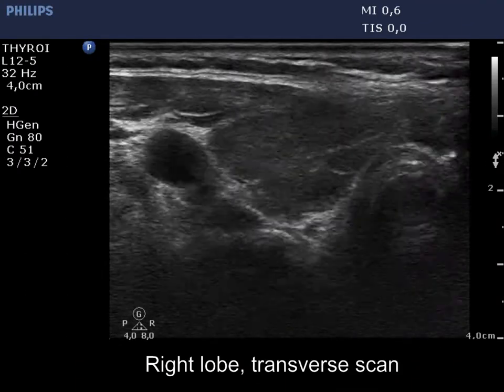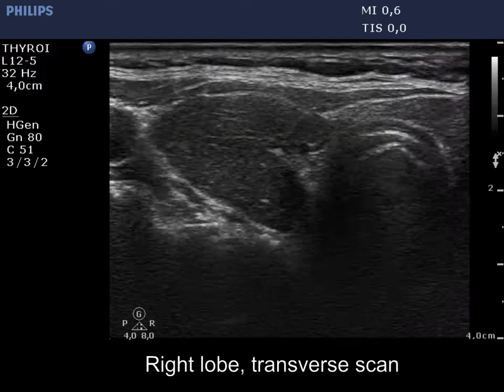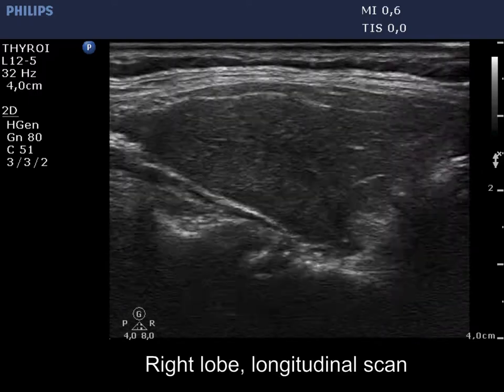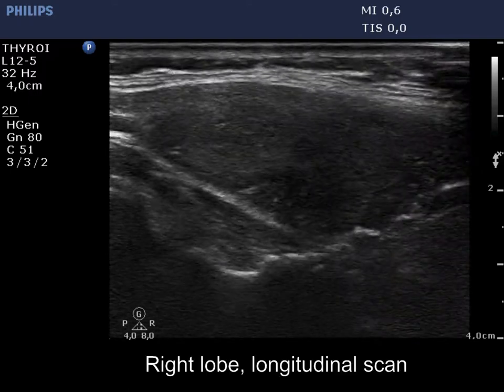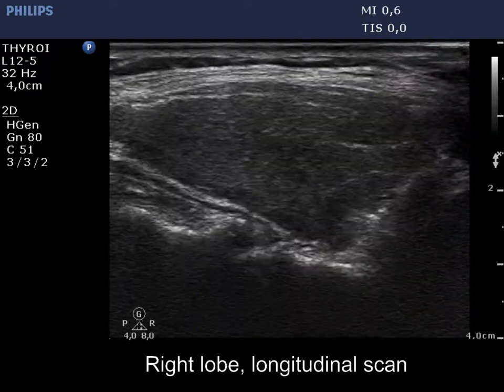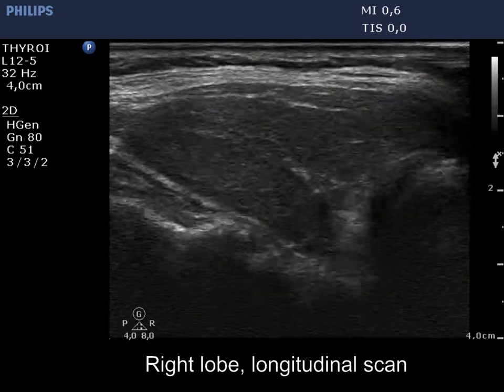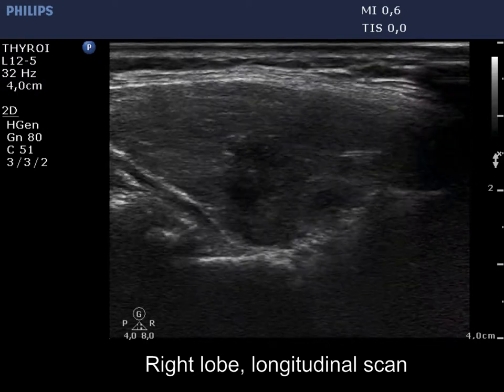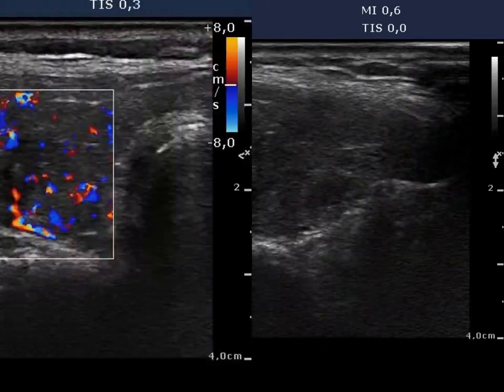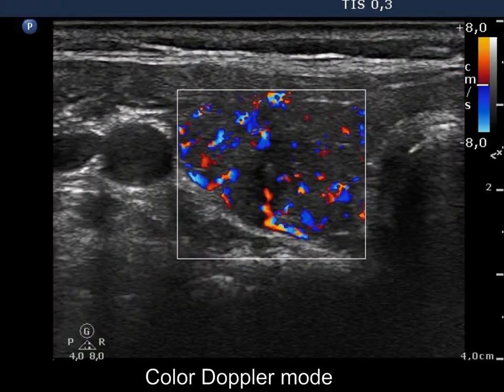The right lobe is hypoechogenic and contains several small, insignificant, more hypoechogenic areas. The vascularization is increased.